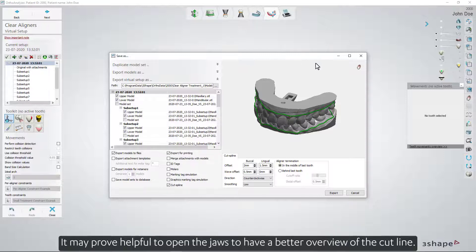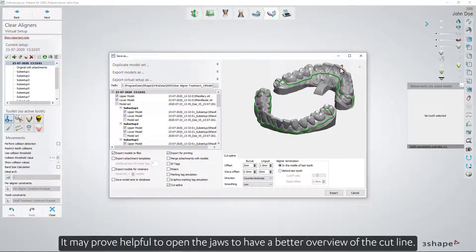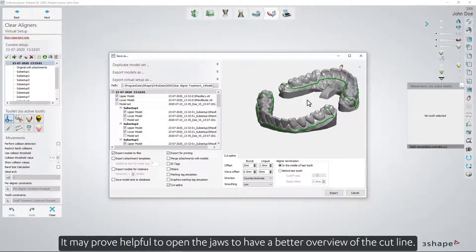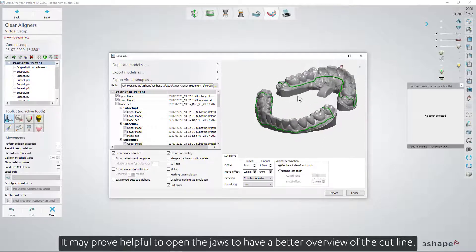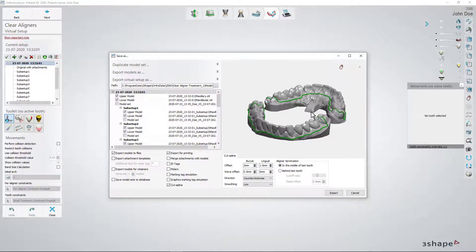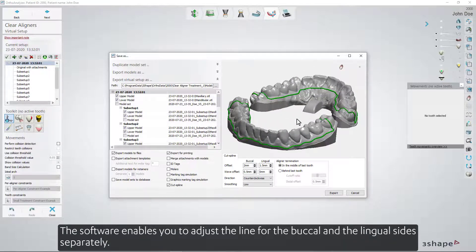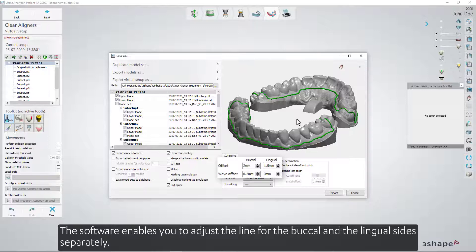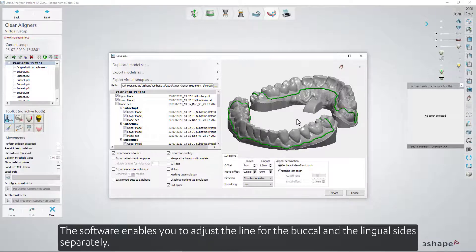It may prove helpful to open the jaws to have a better overview of the cut line. The software enables you to adjust the line for the buccal and the lingual sides separately.